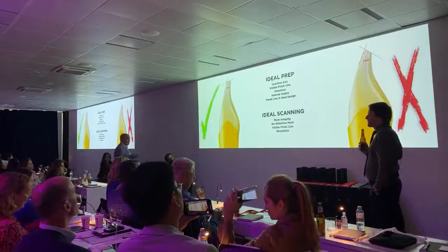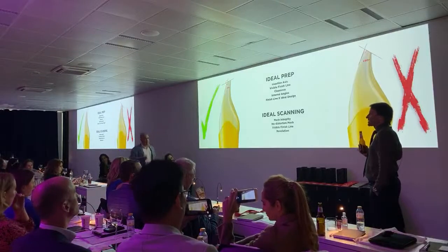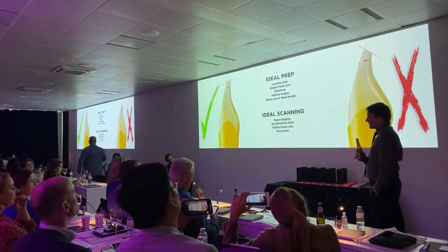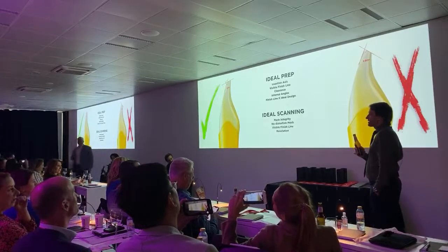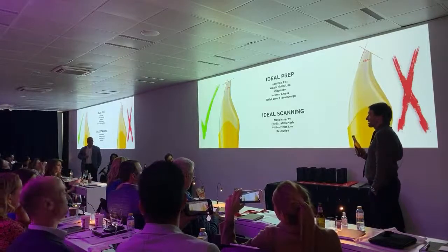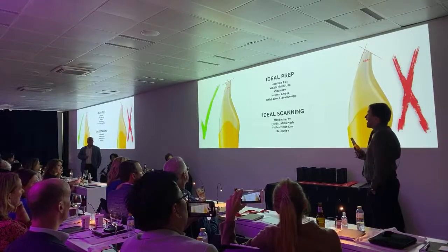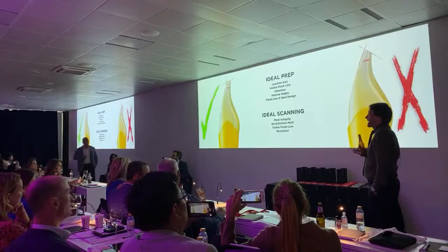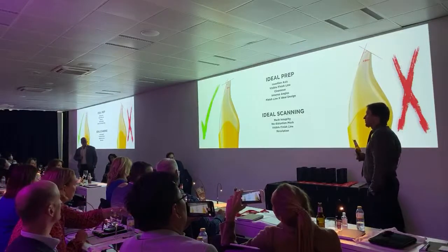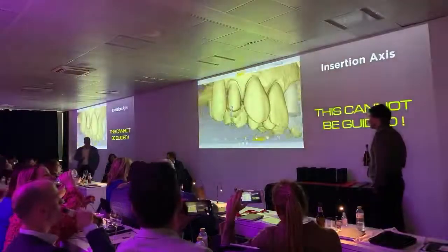Let me say something here. The sharp angles. Don't look at the sharp angle problem as a limitation of CAD. Look at it as CAD saving you. Because if you don't use CAD, technicians will work around it and find a way to do the restoration that, instead of lasting 15 years, will last 6 years and will break and we will not know why. So CAD/CAM is actually making things clear from the inception and allowing us to troubleshoot the problems and create a better workflow.